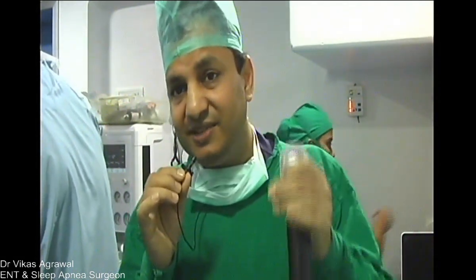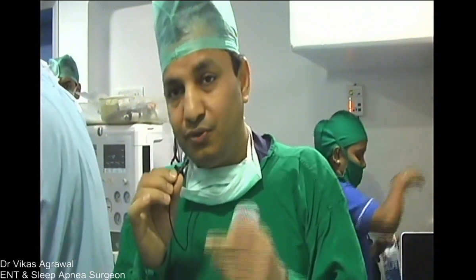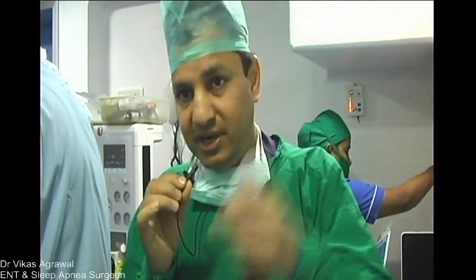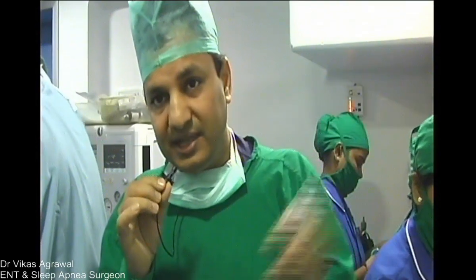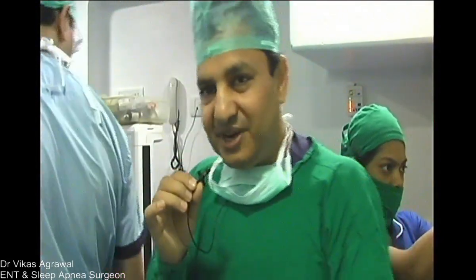That means even if there is some kind of bleeding into the nose, we can always inflate the balloon and the bleeding will not trickle down. So we have two advantages of not completely taking out the tube from the nose. One is that there will be no bleeding because you have not taken the cuff out. Even if there is bleeding, you can inflate the cuff and not let the blood go inside. And the third is that you have a nasopharyngeal airway in place. So these are small things that we have worked our way along.